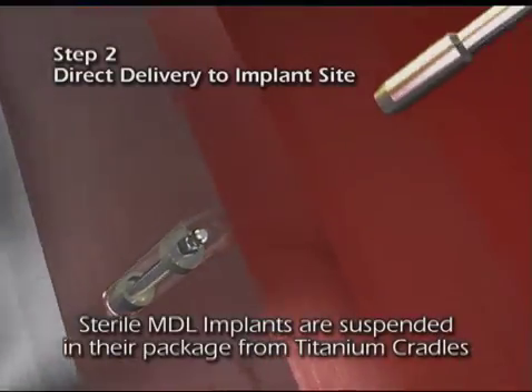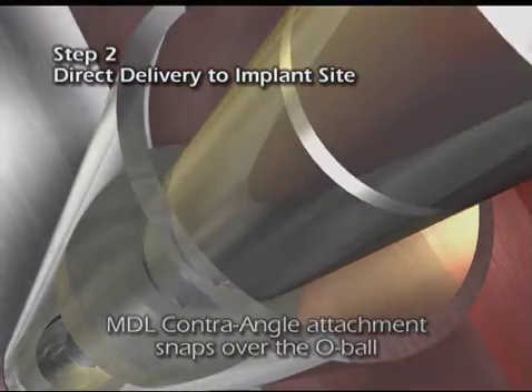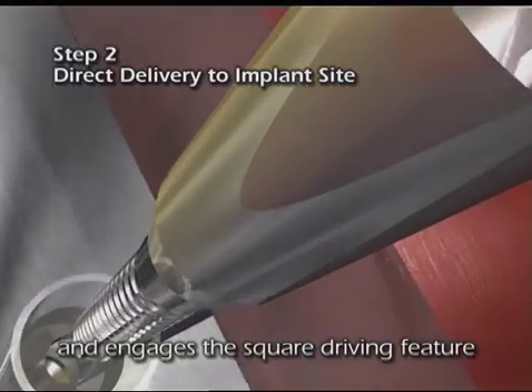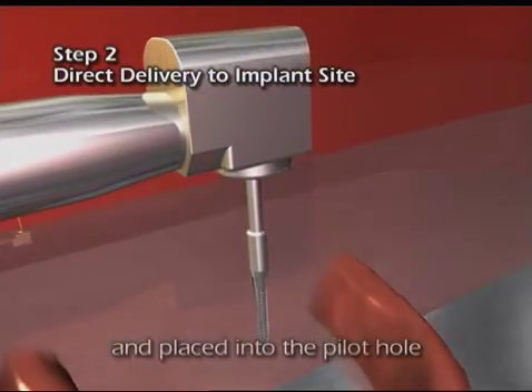MDLs are suspended in their sterile vials from titanium cradles. The MDL contra angle attachment snaps over the O-ball assembly and engages the square driving feature. The implant is transferred directly to the surgical site and placed in the pilot hole.